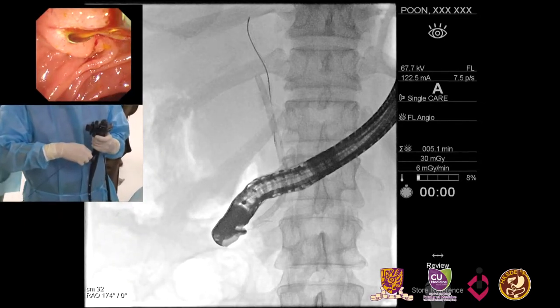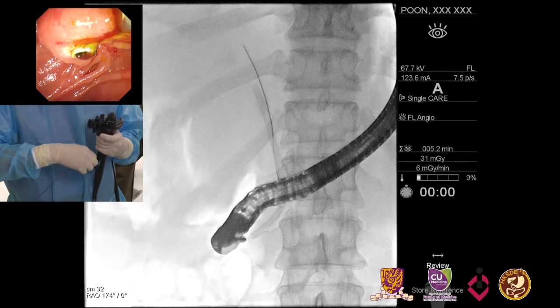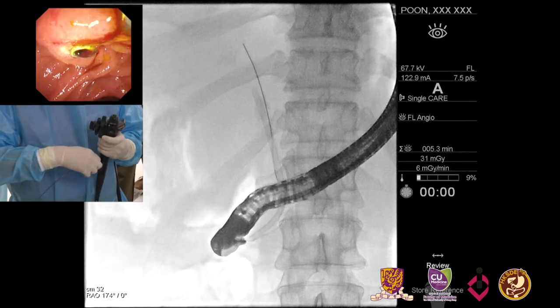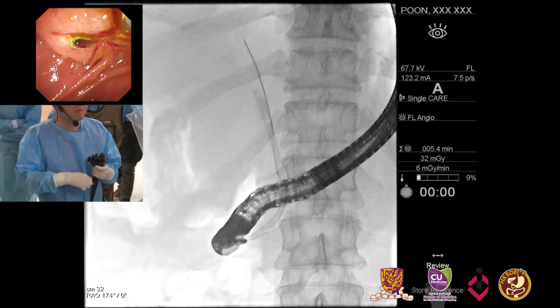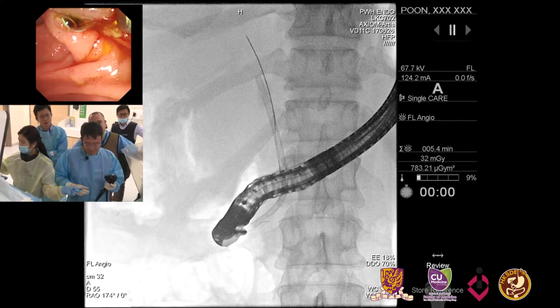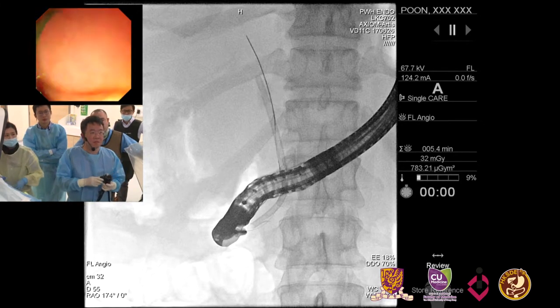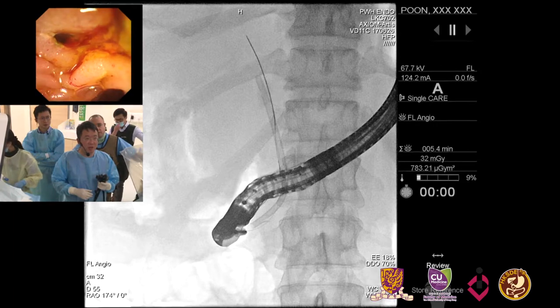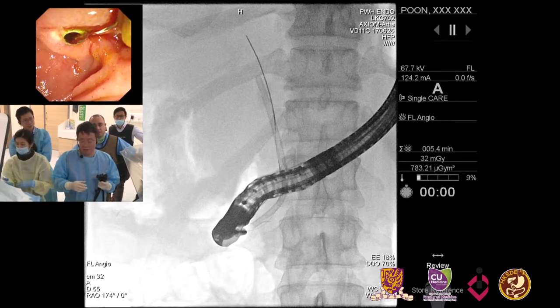Right. If you can see the stent's distal end, the snare would be the easiest choice. But if the stent has all migrated in, there are several options. One is if the balloon catheter can go side by side, then you can try to go up the stent and pull back from the tip of the stent. If you try to slide side by side, it tends to just slide out. If that happens, I tend to prefer a dilation balloon. That gives much more friction. Yes, I agree. There are many options, including the balloon with a little inflation to take out the stent.